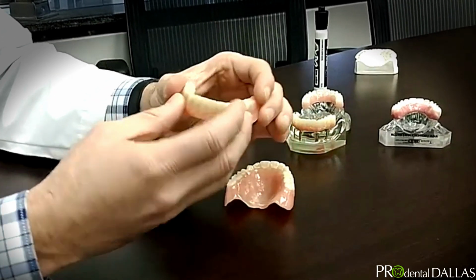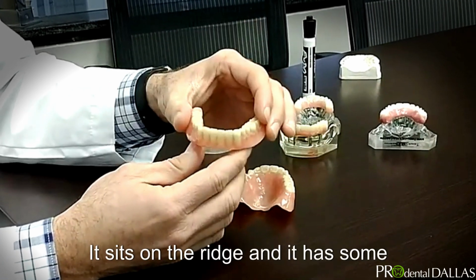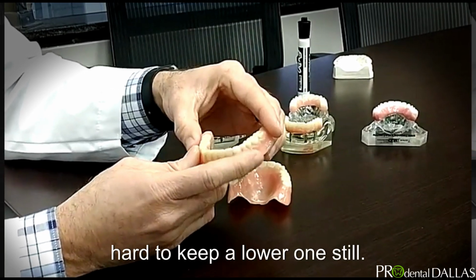The bottom one doesn't really suction against the ridge. It sits on the ridge. It has some minimal retention from the flanges here, but in general, it's hard to keep a lower one still.